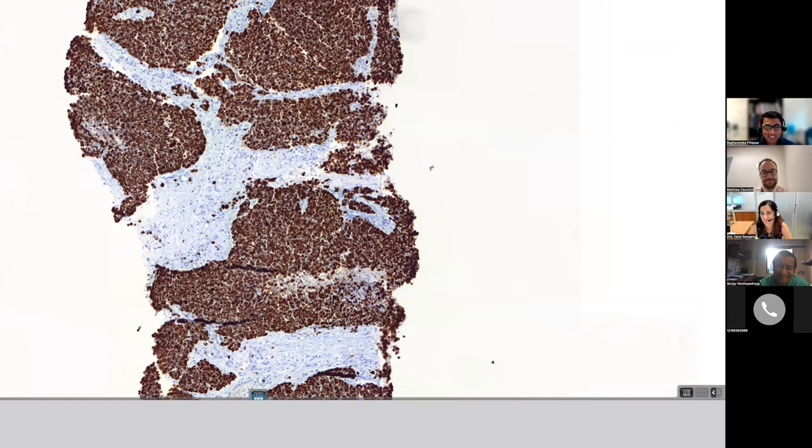Is this the Ki-67 here? Yes, I showed the Ki-67, that it's crazy, crazy positive. What a shock, right? I mean, that's how I feel about the Ki-67 in an overtly high-grade carcinoma.